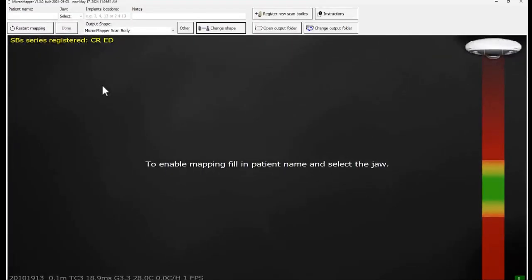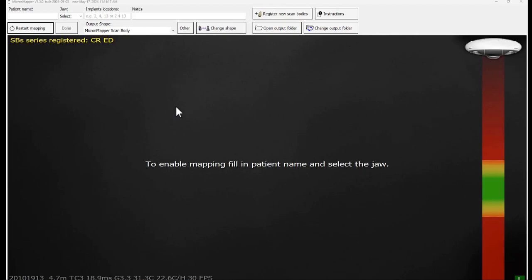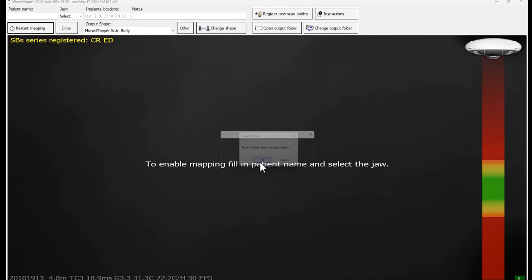If the video quality is still not fixed, select control key and click on restart mapping. This will reset the camera hardware.